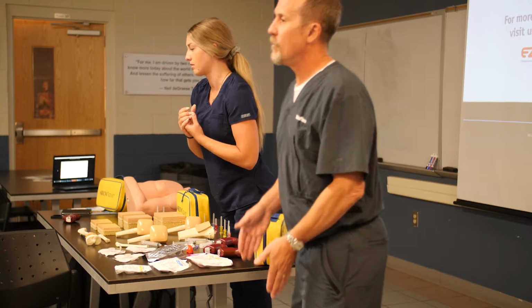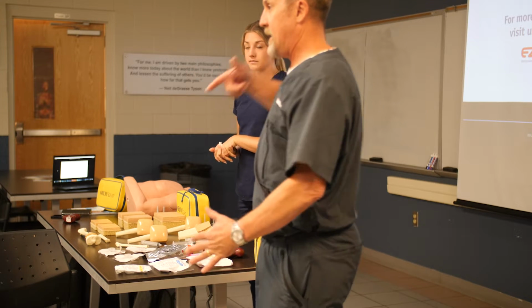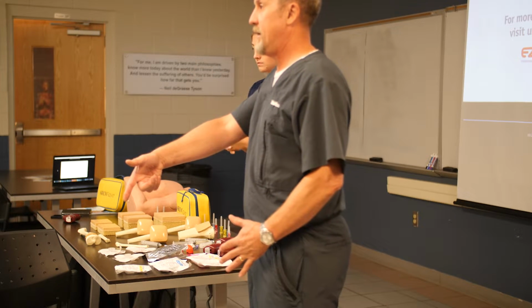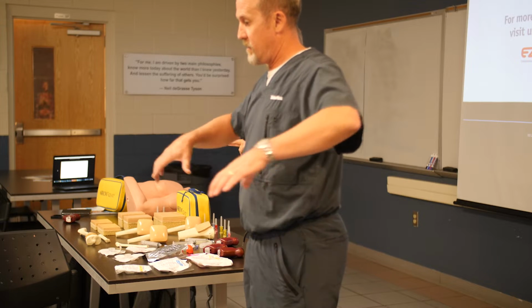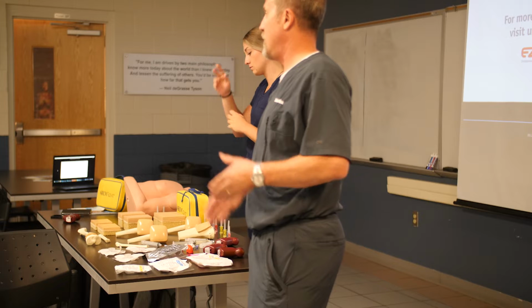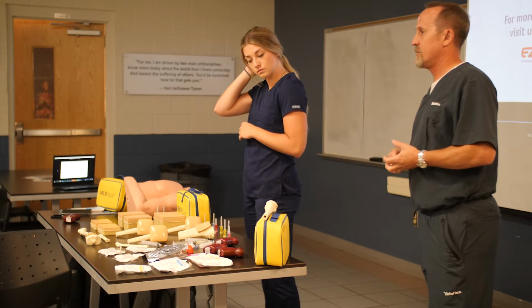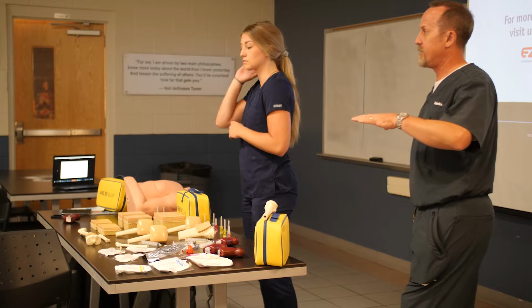Opposite from the side you're on, because we're trying to achieve that medial side of the bone. So being on the opposite side gives you a more direct shot at that bone. Whereas if you're trying to do a leg that's close to you, you're kind of coming back towards yourself. Okay, remember we always go medial side, IO big toe. Any other questions on any of the stuff that we've covered so far?